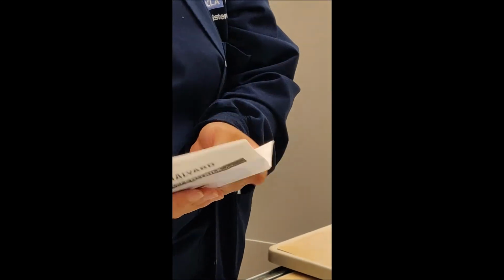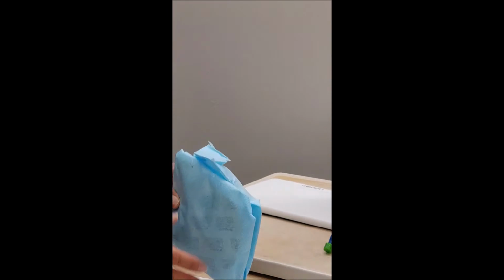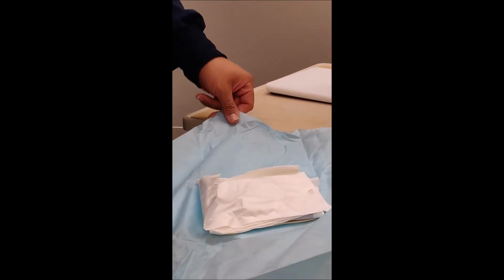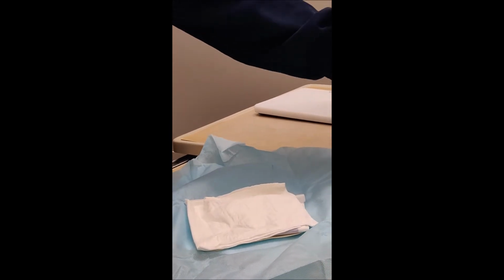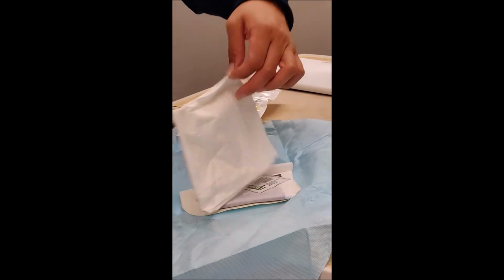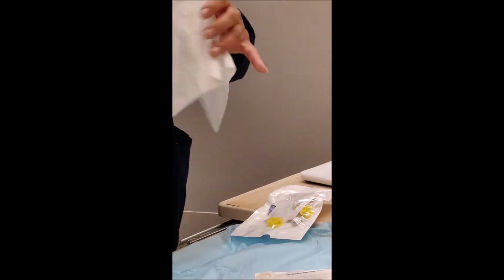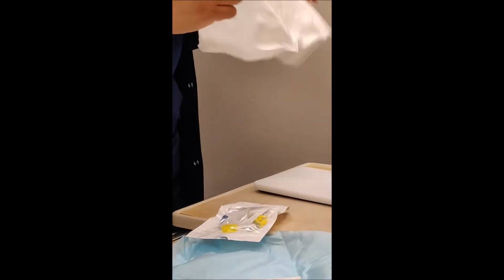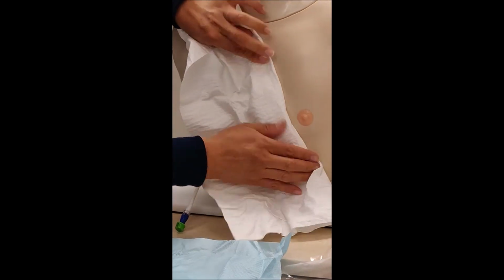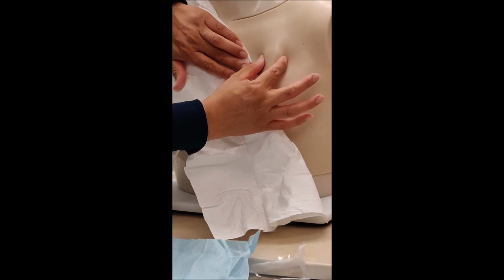And then we would don our sterile gloves, and then we would use these gloves in case we had to change the dressing, then we would do that. The other thing, once we open the kit, it comes with the needle that we're going to need, and then it comes with a drape that we will use. In this case, if the patient had his t-shirt on, then we would just kind of slip it right on the t-shirt, so it could be like this, in this motion where the port is.